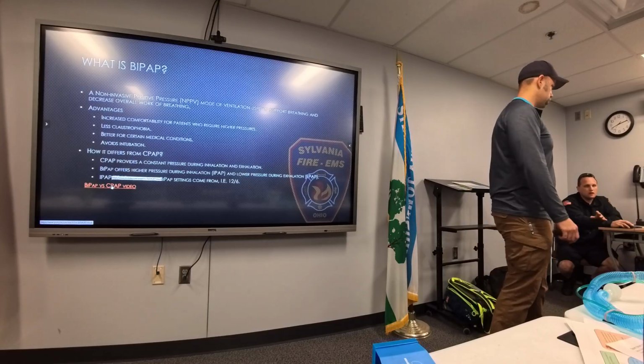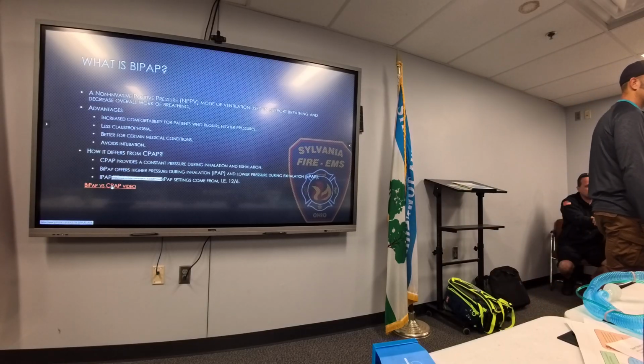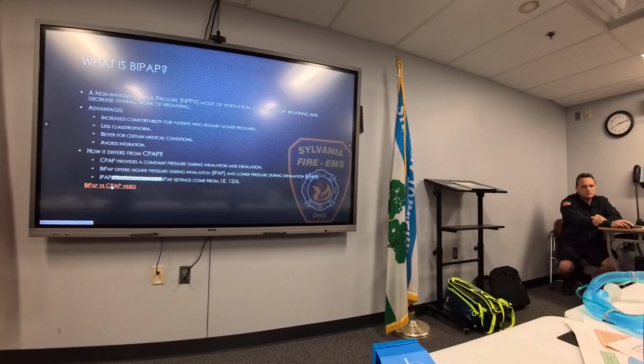Does anyone in here wear CPAP at night? Ever worn a CPAP? I'm supposed to. So you guys know what it feels like, right? That constant pressure coming at you. The BiPAP lowers that pressure so it's easier for you to exhale and get rid of some of that built up carbon dioxide in your blood. It's a lot more comfortable instead of breathing against that constant pressure. So that's why it's going to be a lot more comfortable for a patient.